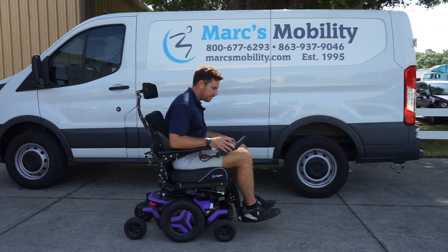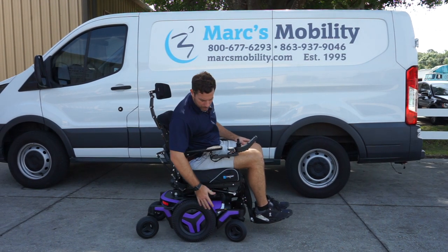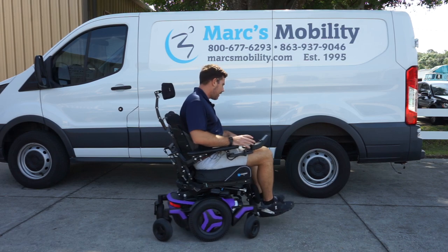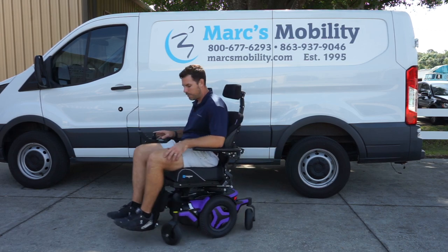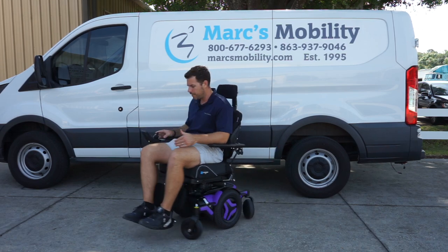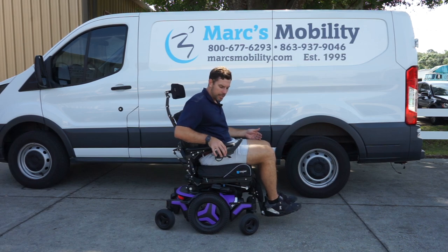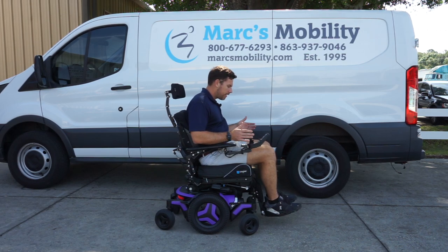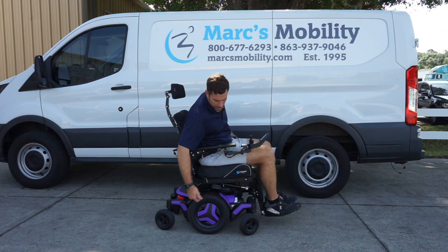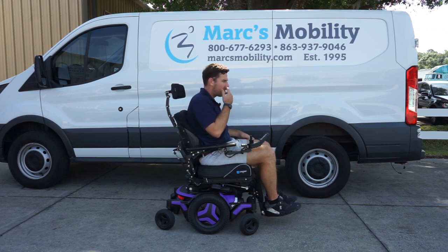This is the Permobil M3, the mid-wheel drive chair. You'll see the turning radius on this unit is super tight — about 42 to 44 inches in total length from the tip of the foot plate to the back, and it turns in its own length. The unit has a swing-away joystick, fantastic suspension, and solid tires front, rear, and drive. It will go through the grass with no problem.